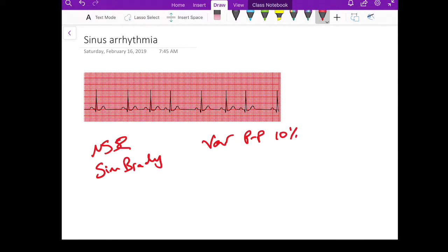If you have a look at this strip, you can see that this P2P is much longer than this P2P, and it's different than this P2P.